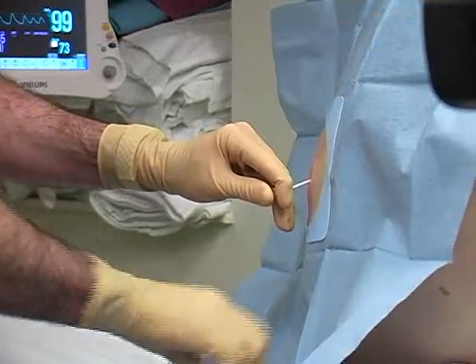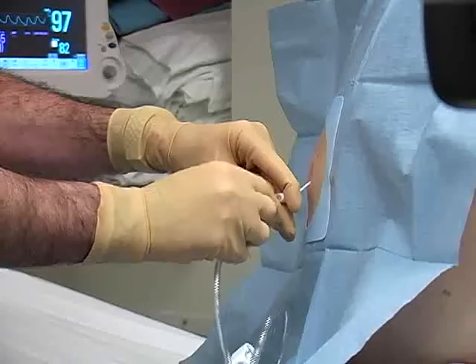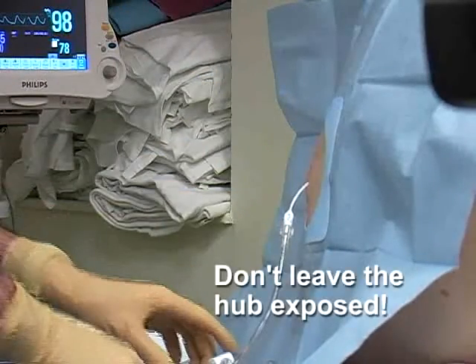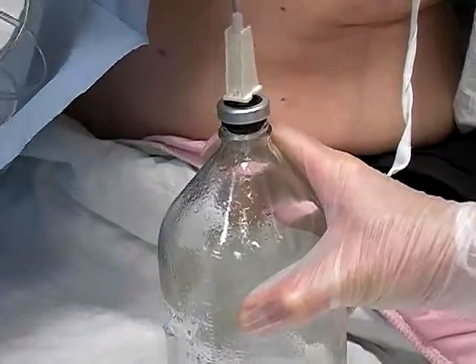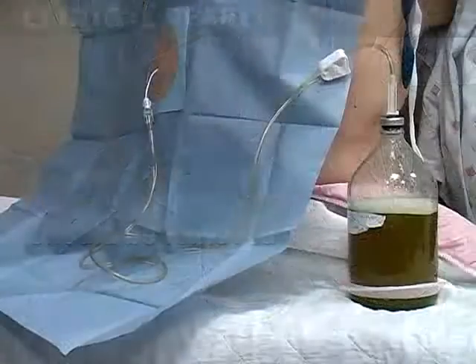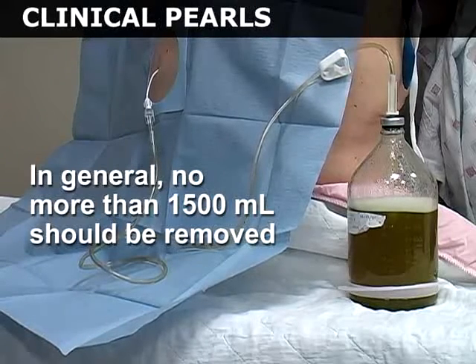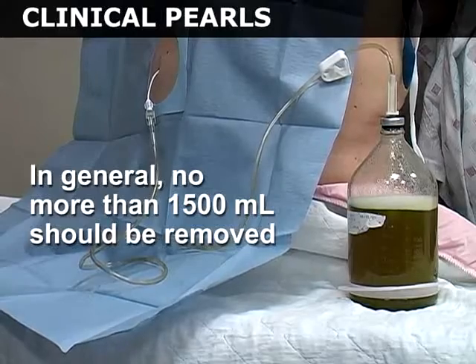If additional fluid needs to be removed for therapeutic purposes, attach high-pressure drainage tubing to the catheter hub or stopcock, again taking care not to leave the hub exposed to the atmosphere. Insert the other end of the tubing into the evacuated container and allow the pleural cavity to drain. In general, no more than 1,500 milliliters of fluid should be removed to prevent the development of post-expansion pulmonary edema.